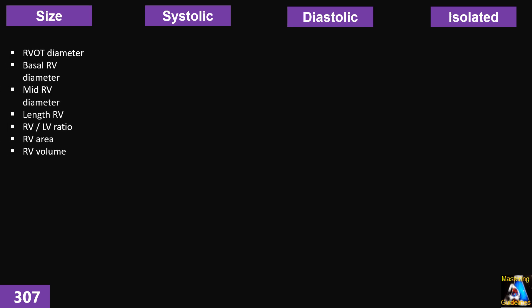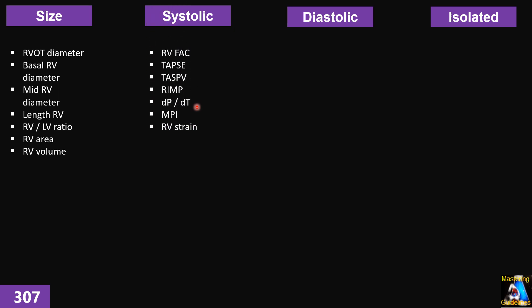For right ventricle size measurement, we use many different parameters, each with different value. Most of the time we use a combination of all of them for evaluation of right ventricle size. These include RVOT diameter, basal and mid dimensions, the length of the right ventricle, and the ratio of right ventricle to left ventricle area and volume.